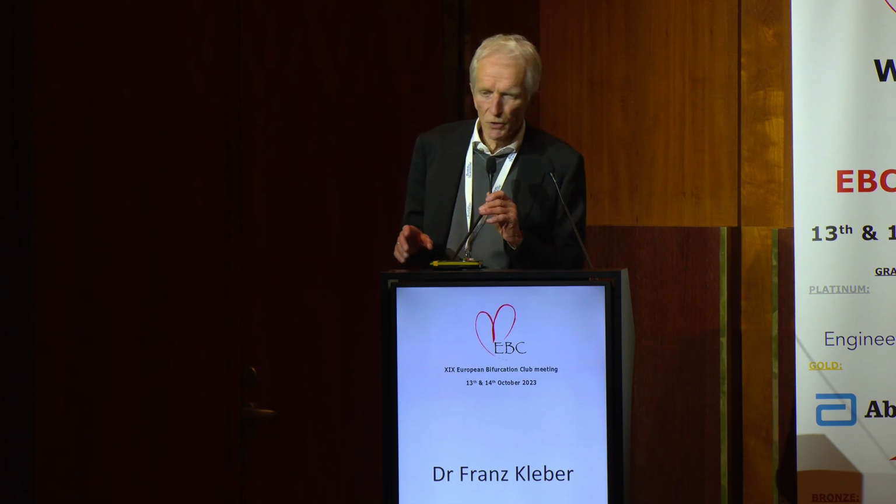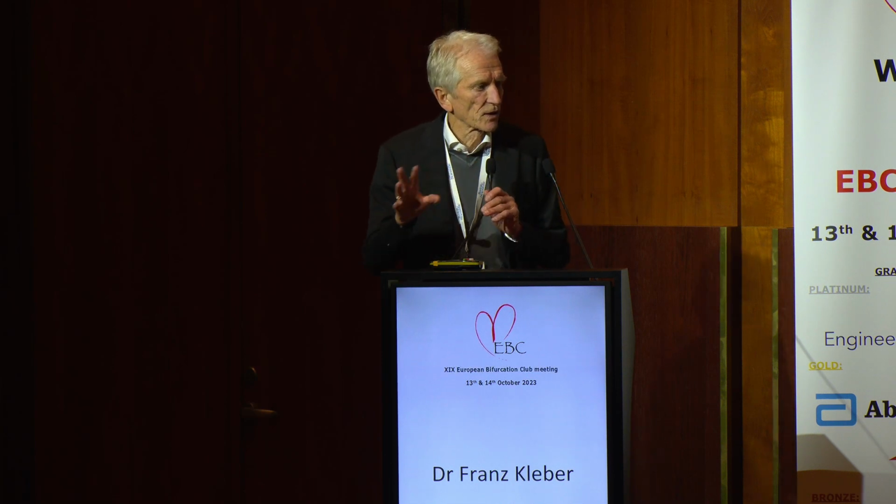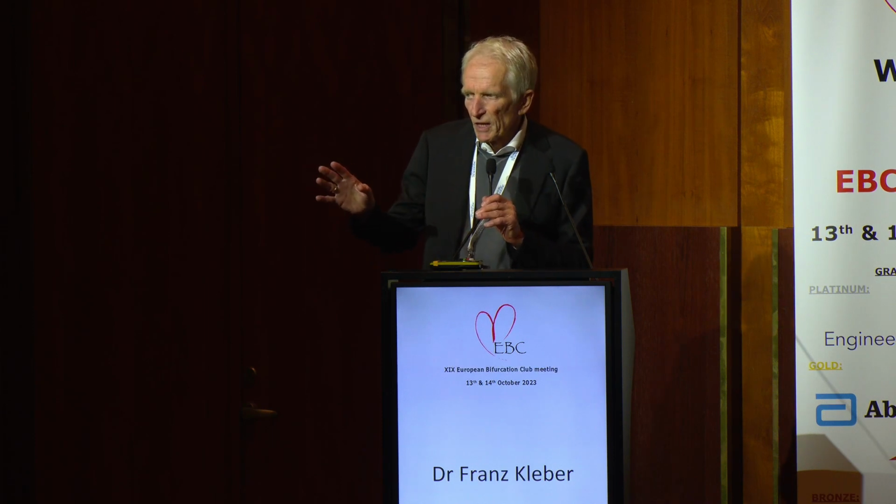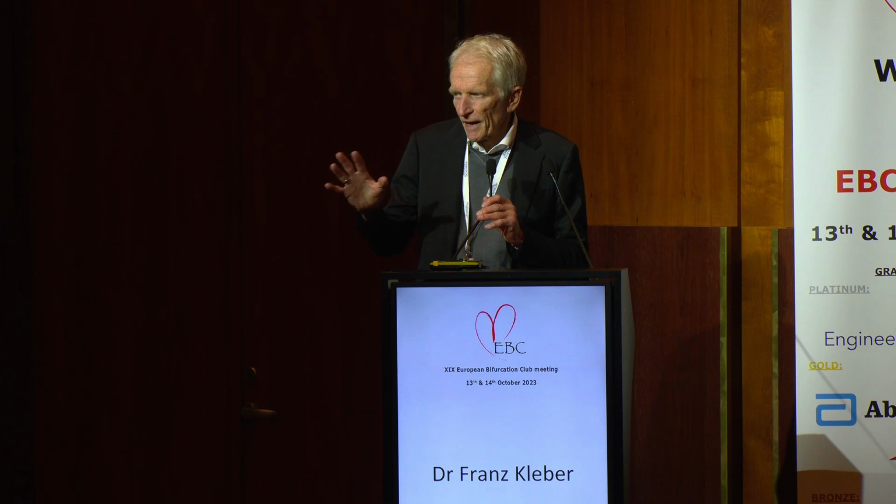I think what we learned is that the ostial side branch has a clear benefit because it also has the drug from the main branch. If you have long lesions in the side branch, I think they will behave like other small vessels.